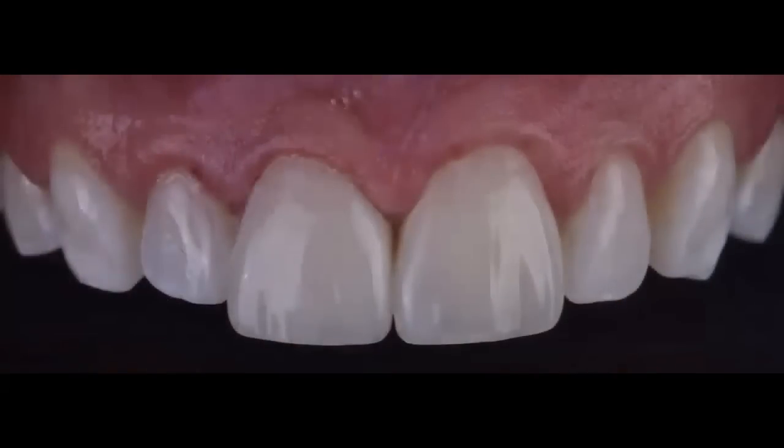So this is my final restoration immediately after rubber dam removal. You can see 8 and 9. You can see the high gloss that I was able to achieve by using Shape Guard. You can see a little bit of the tertiary anatomy, and you can compare that to the lateral incisors.